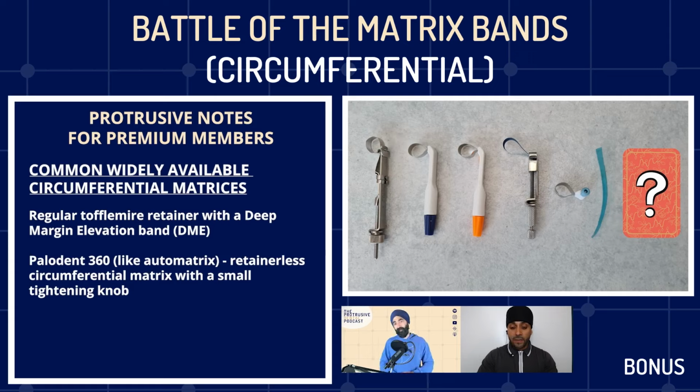Yeah, interestingly, I have a few friends that are using it at the minute, but again, pros and cons, right? Some of them are using it and liking it, and some of them are using it and have disbanded it now. Actually, Sonny, a lot of dentists will use that circumferential band, but for that case, they won't take a photo and they won't post it on social media because it's not cool. It's not cool to use circumferential in this world of sectionals. Sure. But we're making it cool again, so we'll be sharing that.